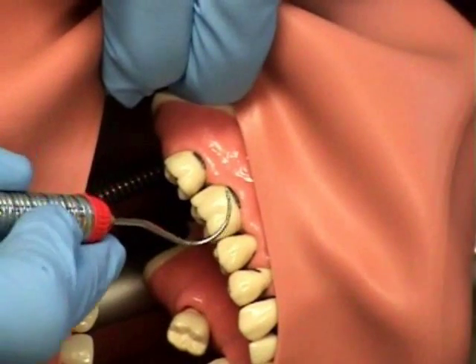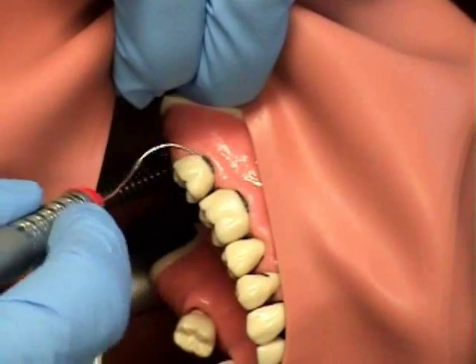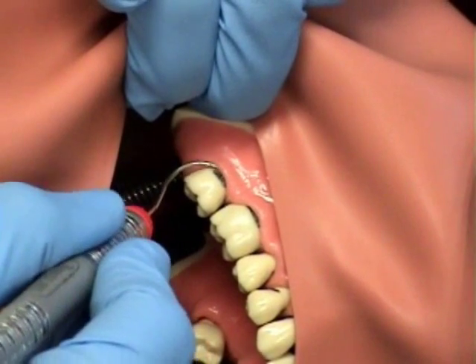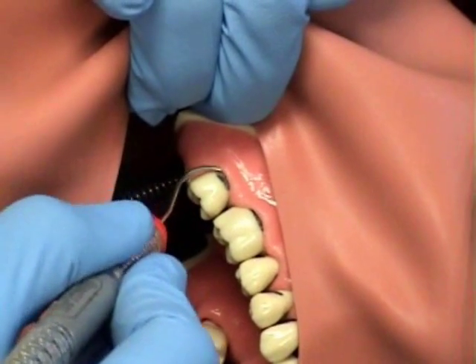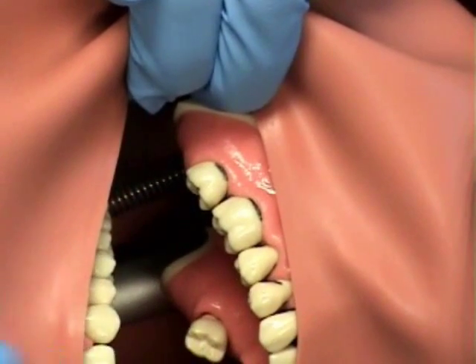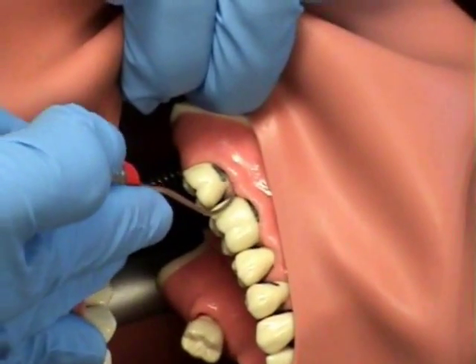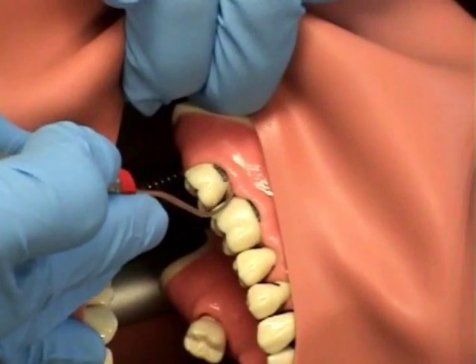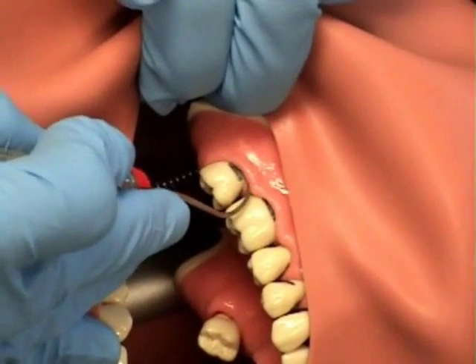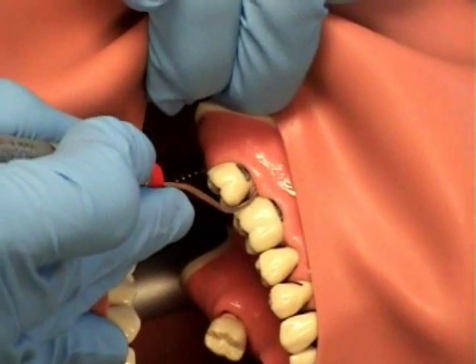The Diamond-Tech file is a paired file that has the Nabers probe style to it. Therefore, it has universal applications. It is excellent for accessing class 3 furcations. The extended shank has a pronounced curve. The mesial end of the Diamond-Tech file is concave. The distal end of the Diamond-Tech file is convex. It works well for line angles and deep developmental grooves.